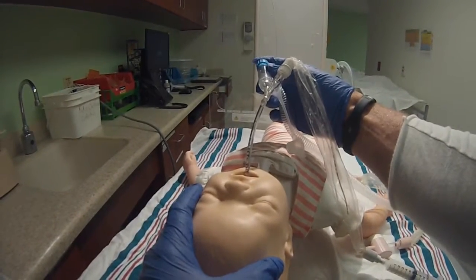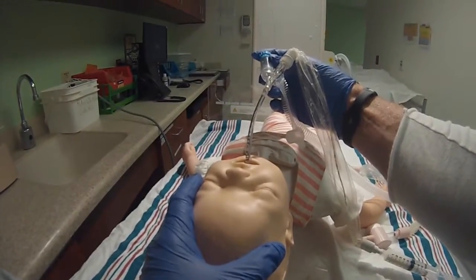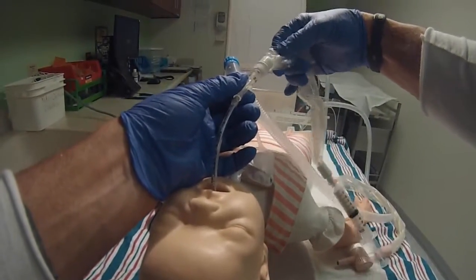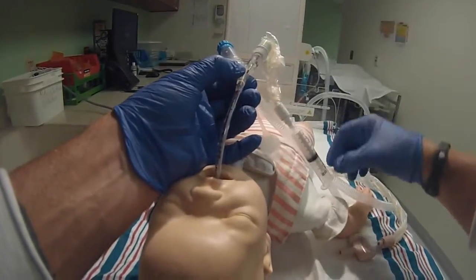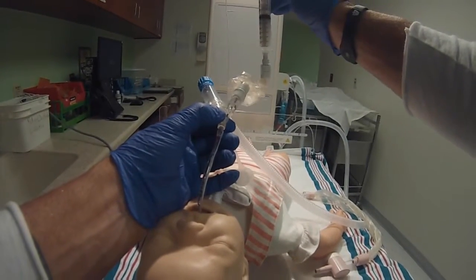Some people like to turn the babies, but lately they've been leaving them flat — that's what the literature says. After a minute, you're going to do it again. You're going to go ahead and push it down to that red mark and line that up with the 12 right there. You know you're at the right place. You're going to push the rest of your InfoSurf in.